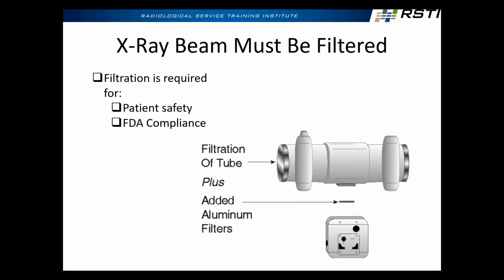Where do we say aluminum was? 13, right? So if aluminum is above adipose and muscle and below bone, here's the deal. In diagnostic imaging, anytime my filter has a higher Z than another structure, it tends to make that structure more transparent. So aluminum is a preferred material for a number of reasons. It's really good at stopping soft radiation, and it's really good at making bone stand out in the image.